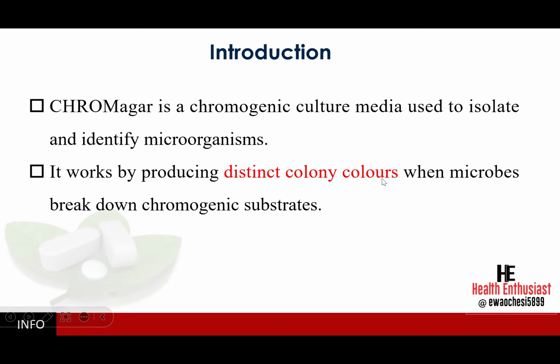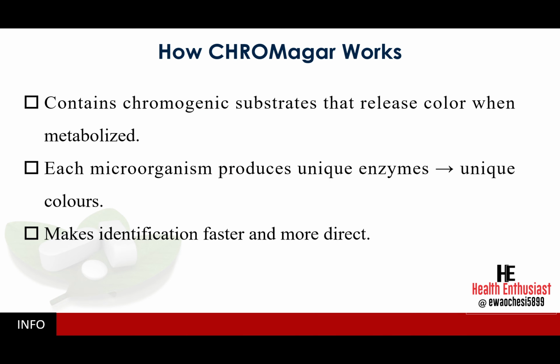Chromogenic agar media are specialized culture media used in microbiology to isolate and identify specific microorganisms. It is often based on the production of distinct color changes. This media essentially incorporates what we call chromogenic substrates. These chromogenic substrates target enzymatic activities unique to particular microorganisms. You know that each microorganism produces unique enzymes. So during the growth of this microorganism, these enzymes will react with the chromogenic substrates.